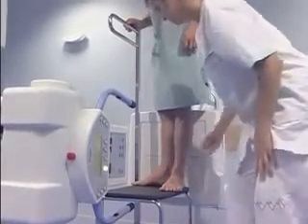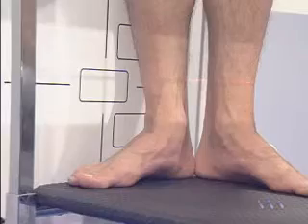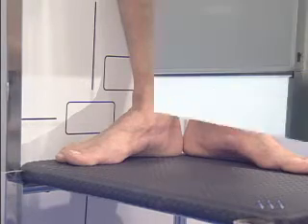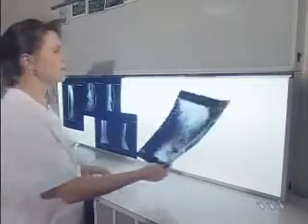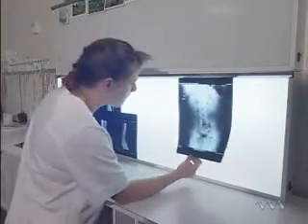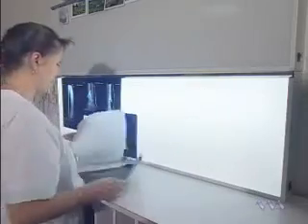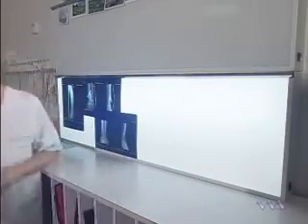The images are immediately available, completing the examination and allowing the patient to leave in a short time. Once the film layout has been prepared, the images can be forwarded to the selected laser printer. The film of the first patient is checked on the viewing box. The film layout can be the high-res RAD one or a combination between the high-res RAD and the laser printer one.